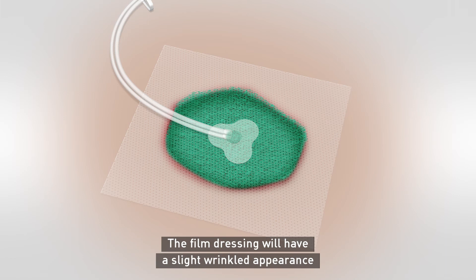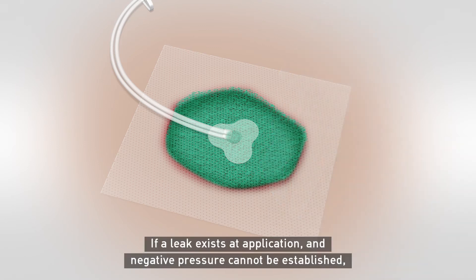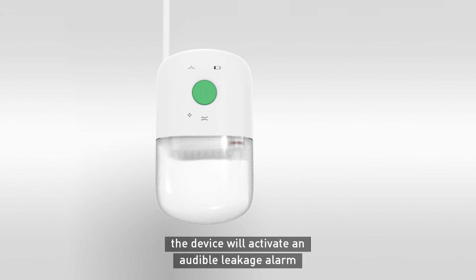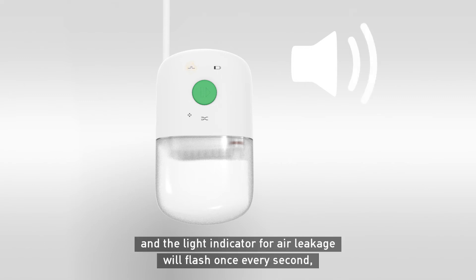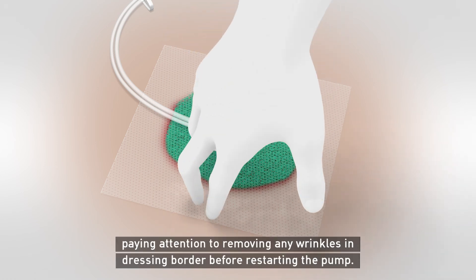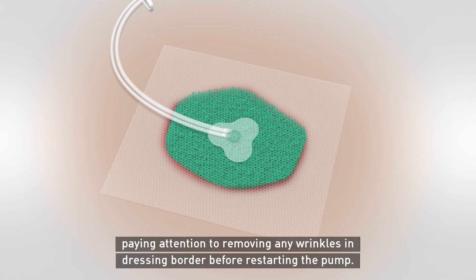You can also observe the dressing contracting as the vacuum is established. The film dressing will have a slight wrinkled appearance and feel firm to the touch once a vacuum seal is achieved. If a leak exists at application and negative pressure cannot be established, the device will activate an audible leakage alarm, and the light indicator for air leakage will flash once every second. The pump will go into pause mode. If this occurs, adjust the dressing, paying attention to remove any wrinkles in the dressing border before restarting the pump.